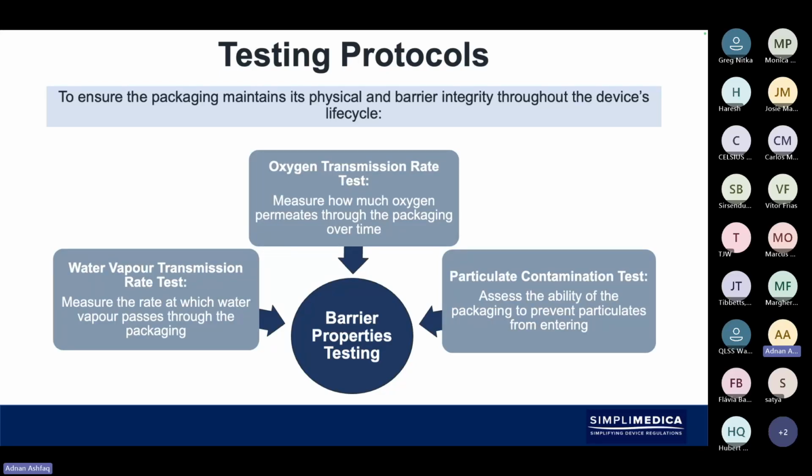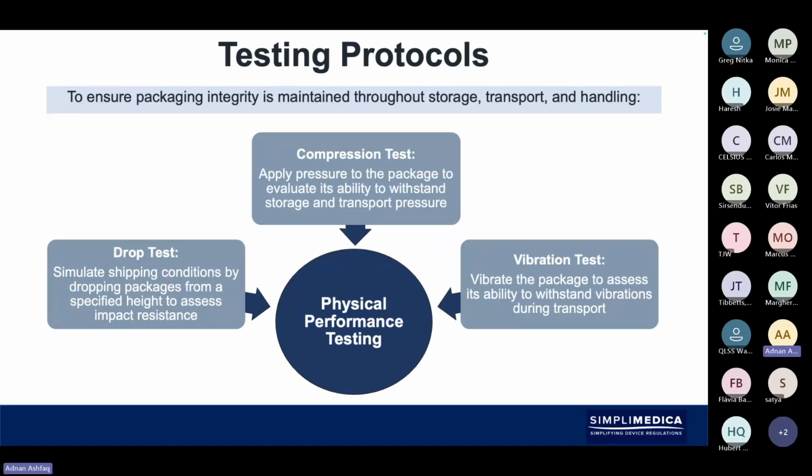This is when you're looking at possibly class 3 medical devices, which really need to have a very high benchmark, and the testing that's going to be done, the specification or the acceptance criteria of the micron level of an acceptable particulate would be really low, and you would then need to look at some of these much more critical tests of the packaging.